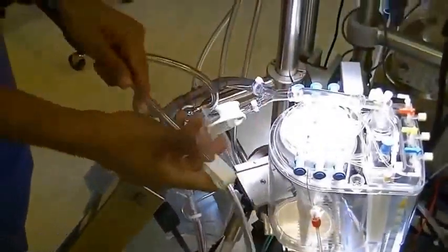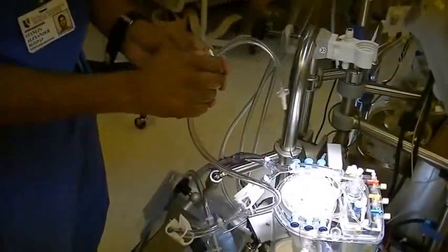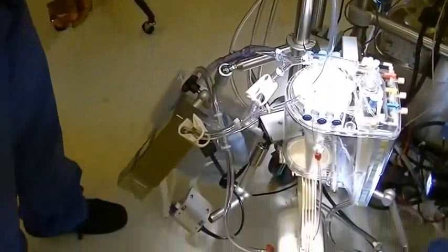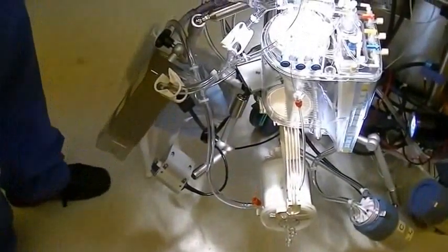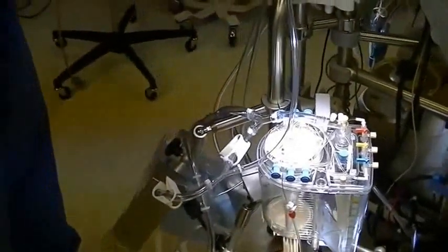Now the next thing you want to do is just clamp this Roberts clamp for now. While you are priming it, you will open it again. The next best thing to do is probably set up the pump suckers in case you are in an emergency and you might have to go on sucker bypass. It might be a good idea to set up the pump suckers.